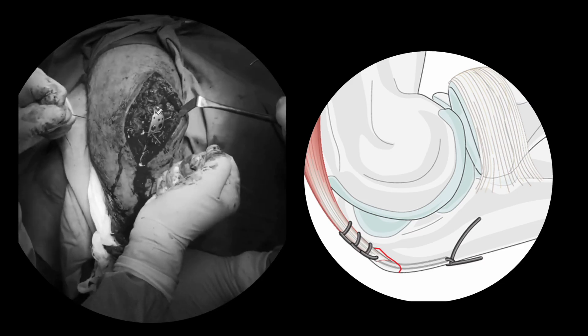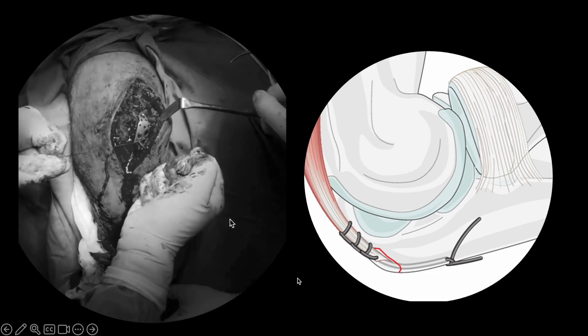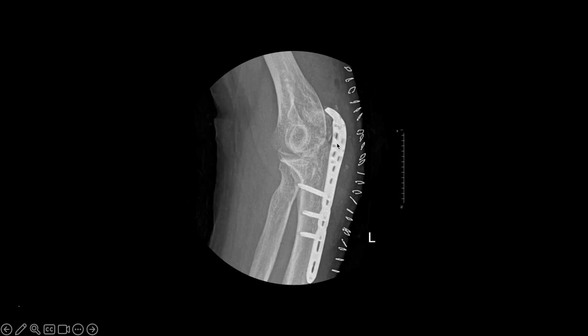You have to ensure that multiple bites are taken in the triceps so that the stability of the fragment you are going to secure with the plate is good. You see the fragment has been secured with the plate and there are no screws in this zone — the plate is only acting as an anchor here. We have taken multiple fiber wire bites and secured each fragment with the plate. The plate is now acting like an anchor securing each major fragment through a fiber wire loop. This triceps avulsion fragment is secured in a good manner because of the fiber wire bites passed through the holes of the plate. These small fragments are also secured with the help of separate bites through the plate holes, so the plate is functioning as a broad anchor for containing each fragment in its place.